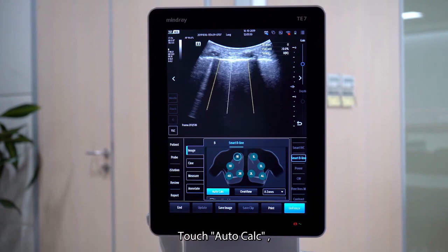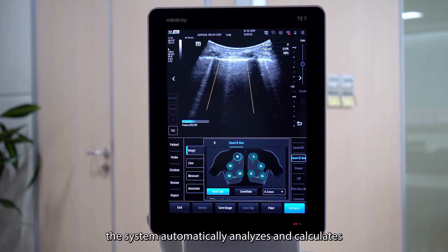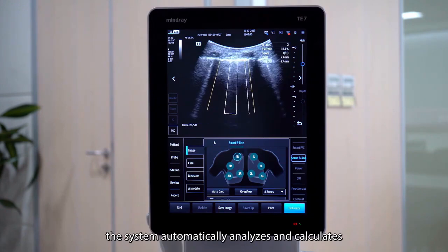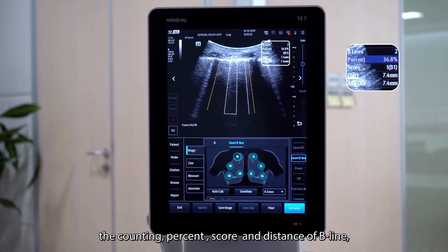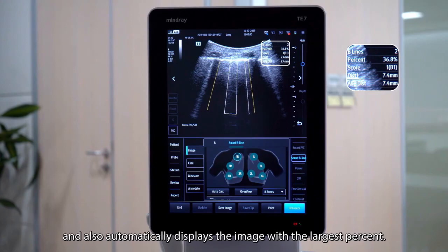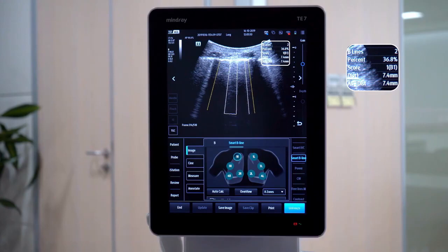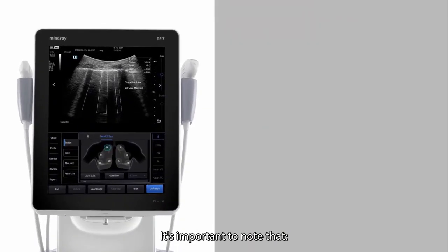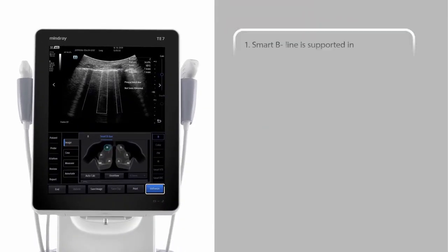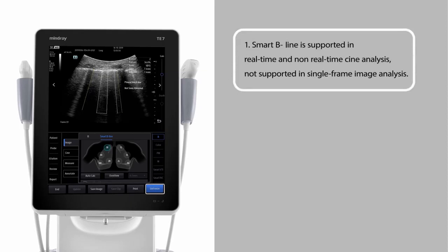Touch auto-calculate. The system automatically analyzes and calculates the counting, percent, score, and distance of B-lines, and also automatically displays the image with the largest percent. It's important to note that Smart B-line is supported in real-time and non-real-time cine analysis, but not supported in single-frame image analysis.